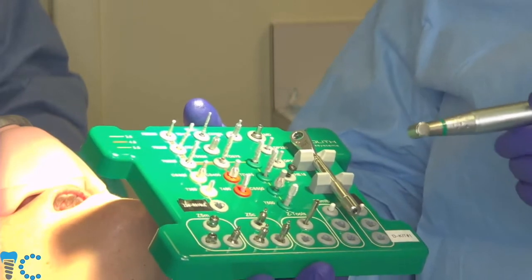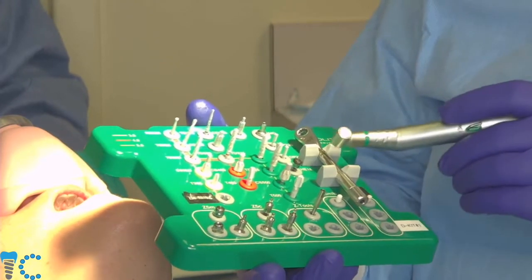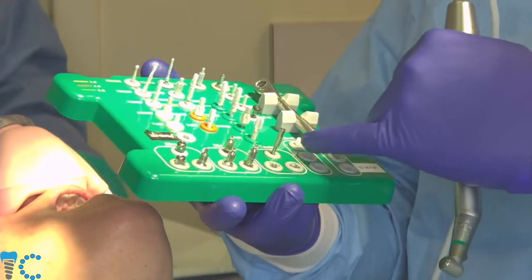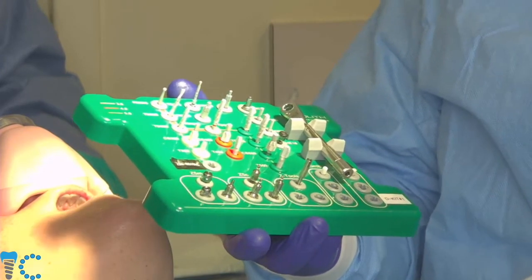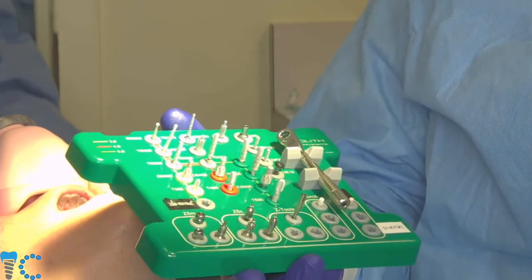So that, in a nutshell, is a surgical kit, plus the torque ratchet, the placement device. This is how we place our implants. You might notice right next to the ratchet, we have a pair of abutments, actual restorative abutments that we keep in our kit. And again, once we place our implant, we use the straight or the angled abutment to confirm proper placement of our implant.